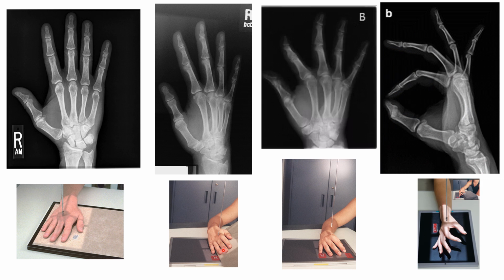In relation to this positioning, you can see that here the phalanges are actually making an angle toward the IR. The fingertips are touching the IR, whereas the palm of the hand, the metacarpals, are rotated 45 degrees away from the IR.